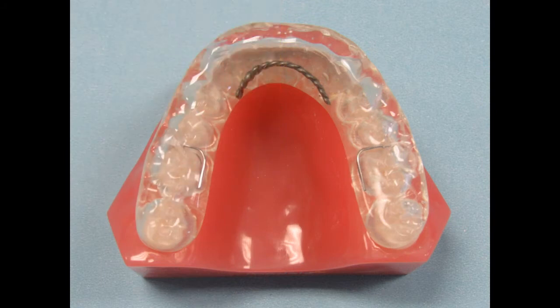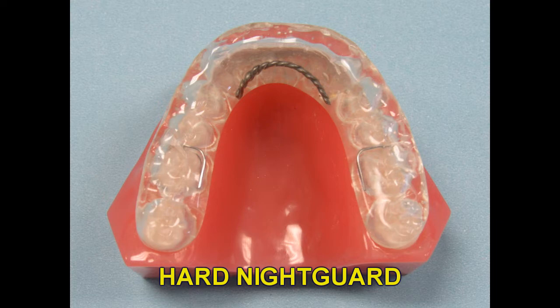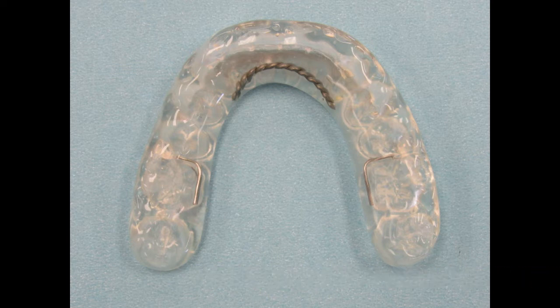The most popular night guard that we fabricate is the hard acrylic night guard or bruxism splint. This appliance is made of a clear hard acrylic and held in place with ball clasps. A strengthening wire is added to improve the durability of the appliance. It can be made to be worn on the upper or the lower arch — usually the doctor's preference, and we make about 50% uppers and 50% lowers. The hard acrylic night guard is designed to protect the teeth and restorations from the harmful effects of nighttime bruxing and grinding.